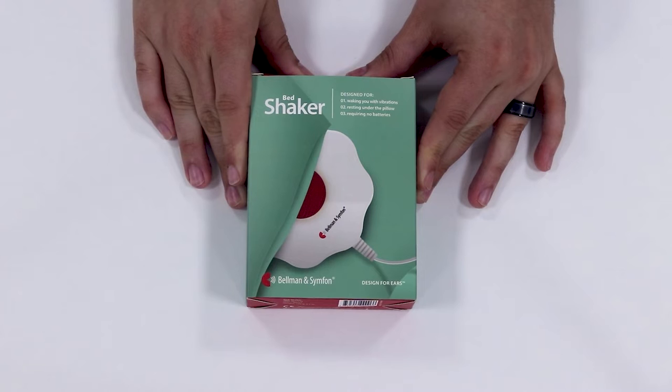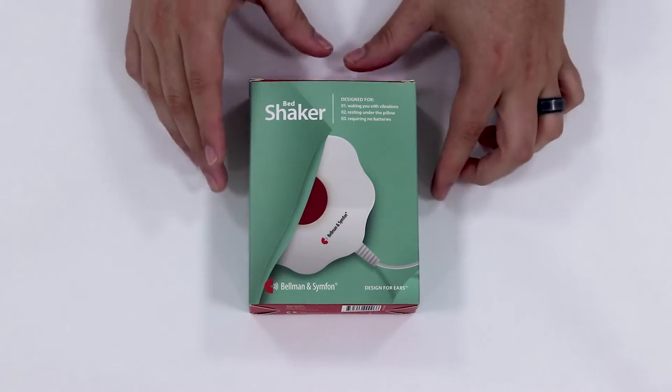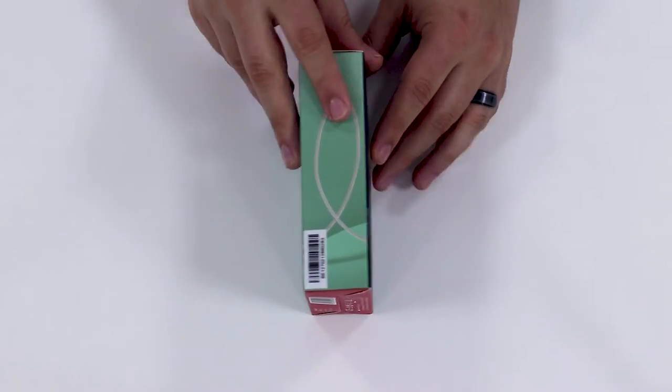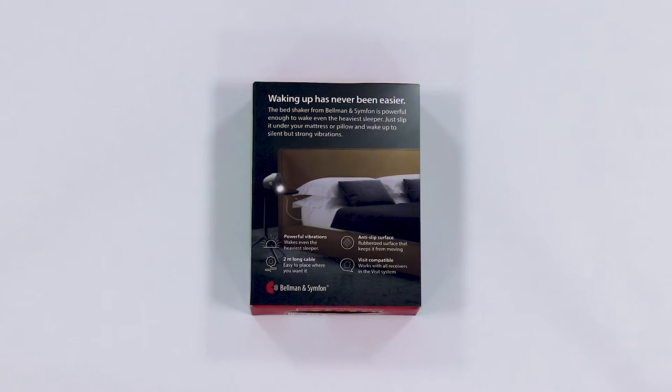The Bed Shaker from Bellamin and Symphon is an accessory that works together with the Bellamin receivers to provide an additional notification of strong vibrations. Normally you can place it under your pillow or mattress.